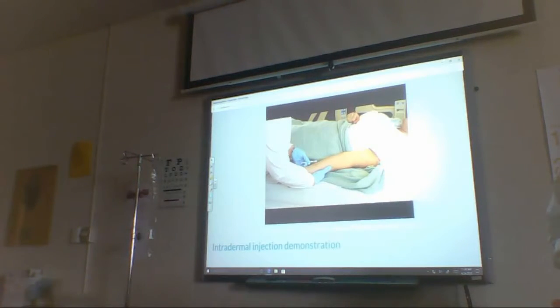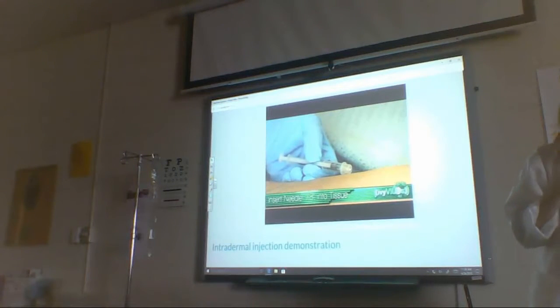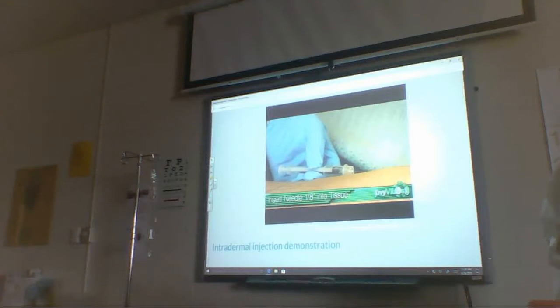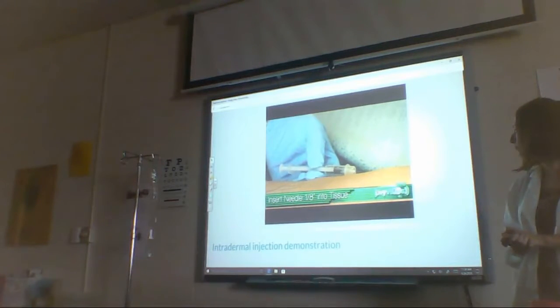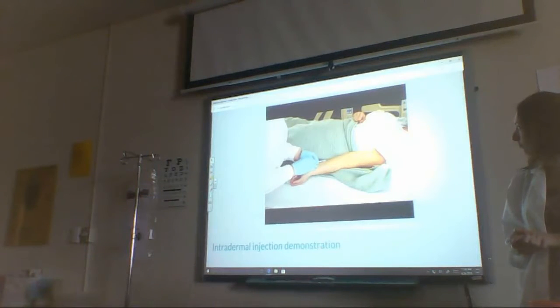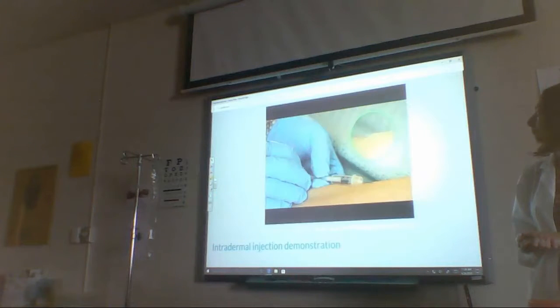Dart the needle into the tissue quickly. Insert the needle about 1/8 of an inch deep into the tissue. Once the needle is in place, use the thumb and forefinger of the non-dominant hand to keep the lower end of the syringe steady. Slide your dominant hand to the end of the plunger. Inject medication slowly. While injecting, look for a small wheal or blister to appear.